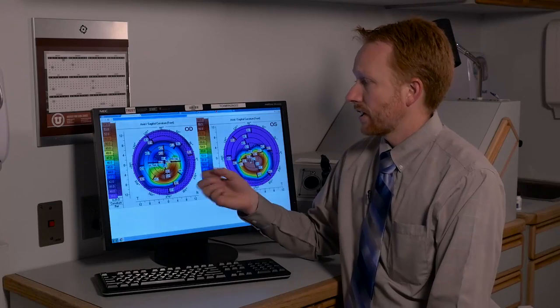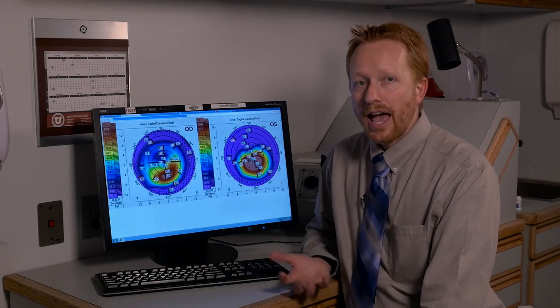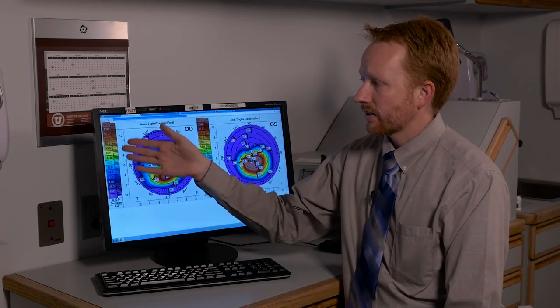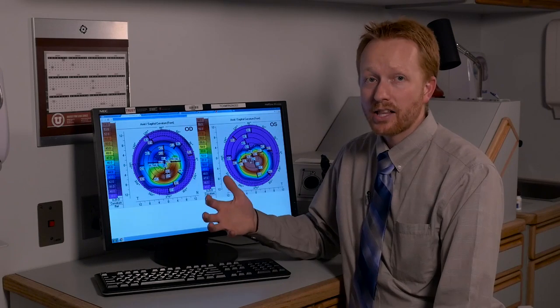For example, here we have an image of the right and the left eye. This is an axial image of the front surface of the cornea. As you can see there's a scale here that shows the relative curvatures of the cornea from flat to steep. The steeper numbers tend to be represented in reds and yellows and the flatter numbers tend to be in blues and purples.